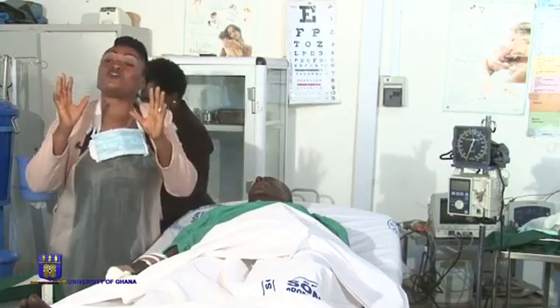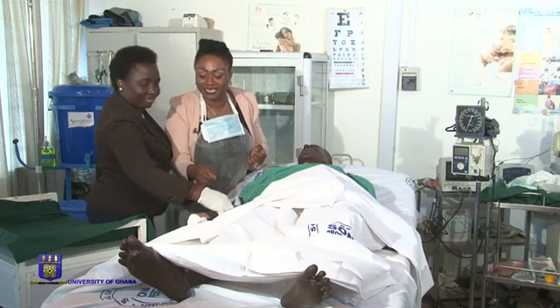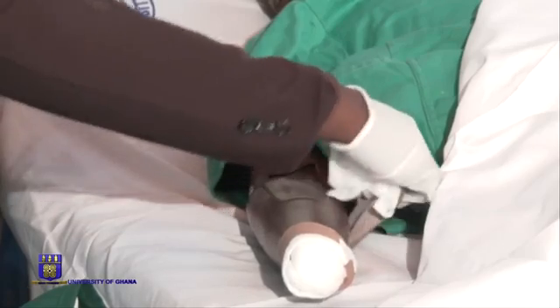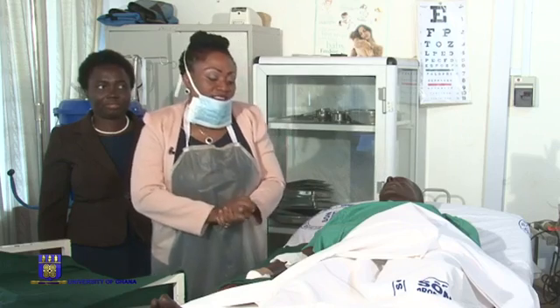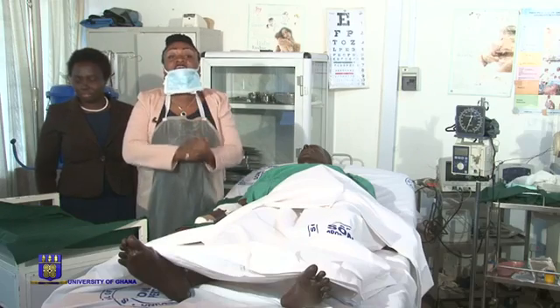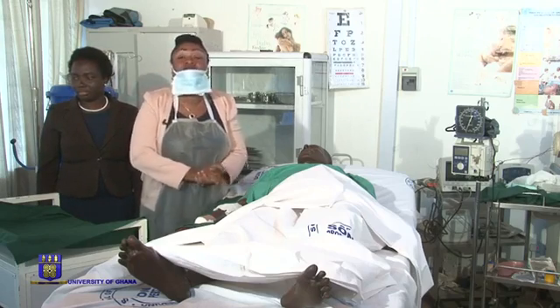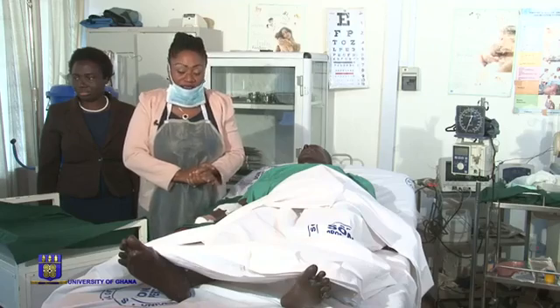So this is the wound dressing technique with 2 nurses, or with an assistant. So the assistant has now provided privacy. The old plaster which was applied to the wound has been removed, leaving one of the gauzes. If the entire gauze is removed, then we cover the wound with a fresh gauze. The wound is not supposed to be laid bare.